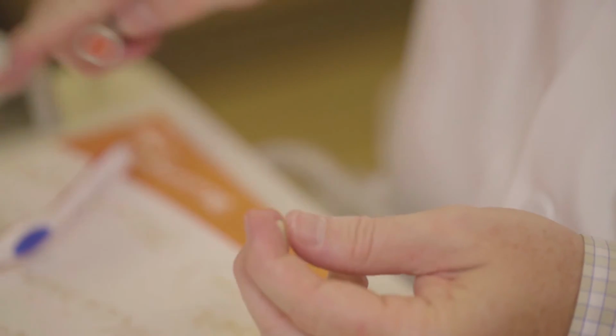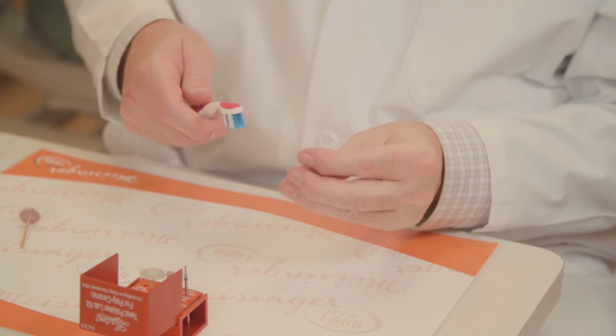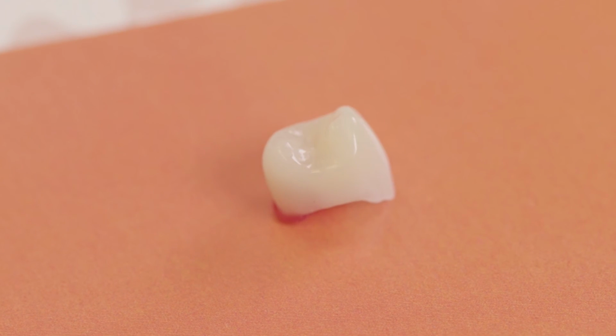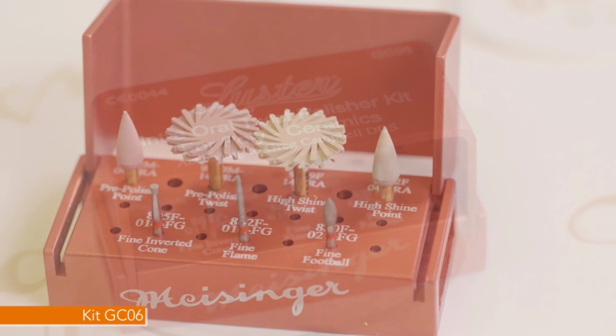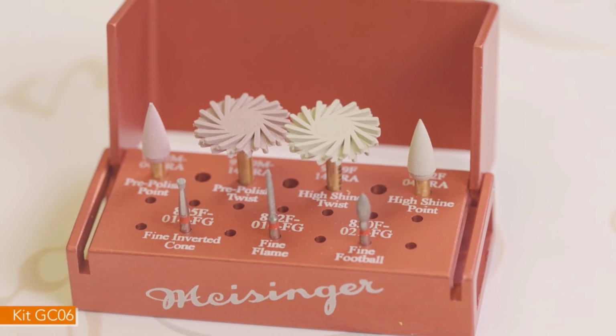It's an optional step. Not everybody needs to use it, not everybody wants to use it, but it's just one more tool you have in your back pocket if you deem that you want to use that. So just a note, there is an intraoral version of this kit after you've submitted your restoration. It's the GC06, and after you've adjusted your contacts, that kit will allow you to get a very high gloss just like we did with the extraoral kit.